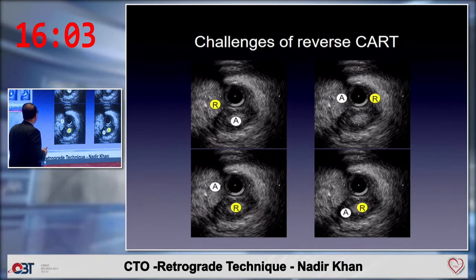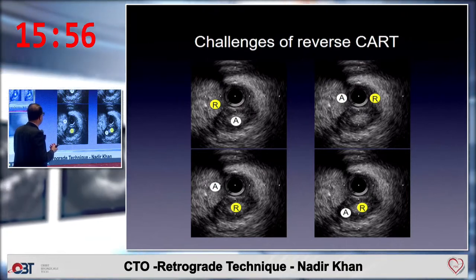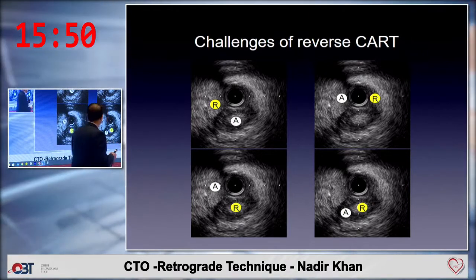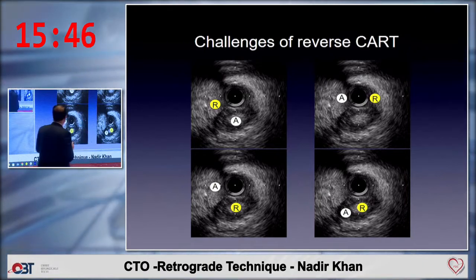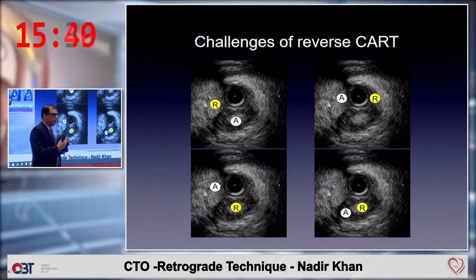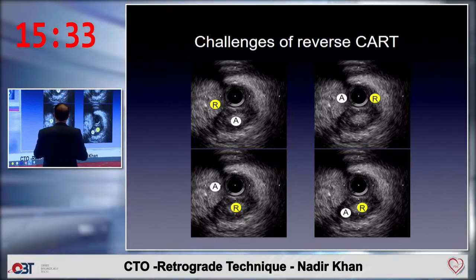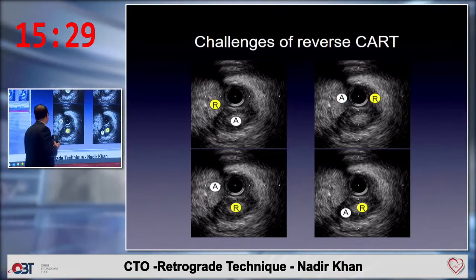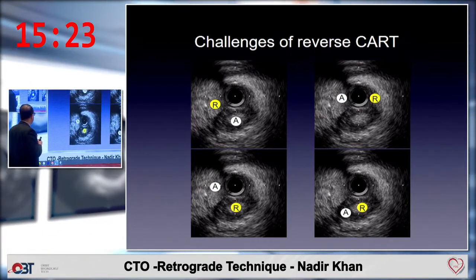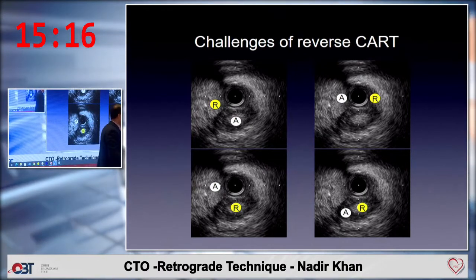So these are the challenges in reverse CART. If both the wires are subintimal, that is not a problem because you can connect both the wires by inflating a balloon. But if you have an antegrade wire that is luminal and a retrograde wire subintimal, or the other way around, the retrograde wire is luminal, then the connection is a bit difficult. You can diagnose these problems by IVUS. This is what is being shown, and the various possibilities of antegrade and retrograde wire positions in reverse CART. So, Umar, could you explain a bit about reverse CART and the problems?